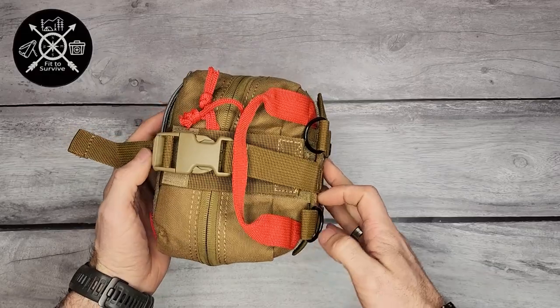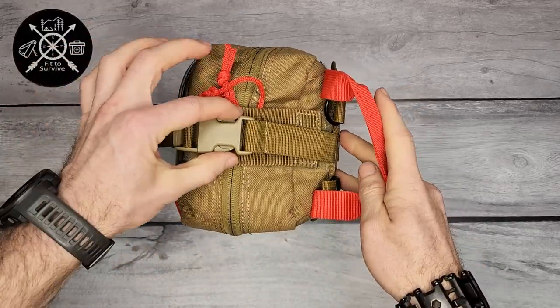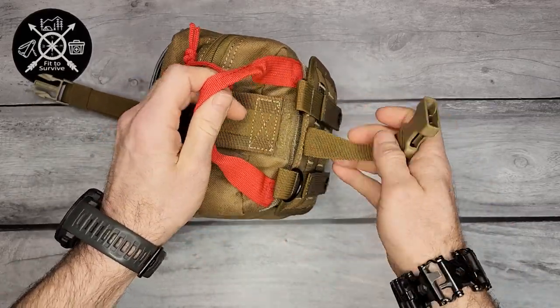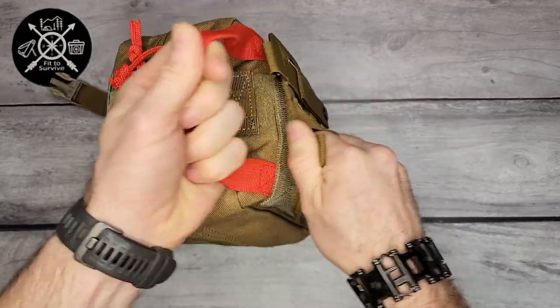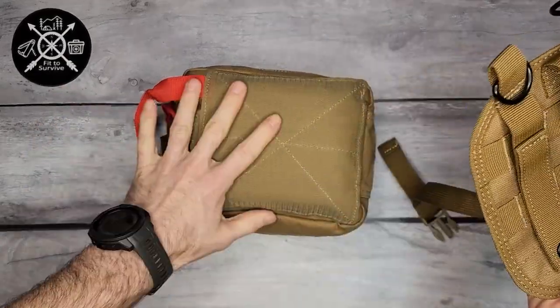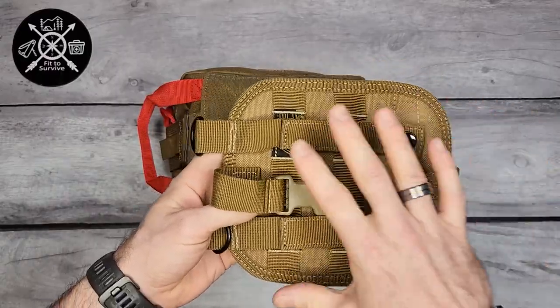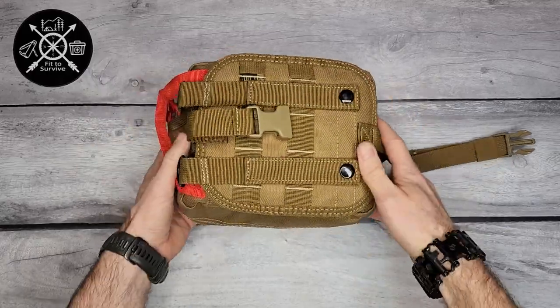The cool thing about this back section that connects to your belt or backpack is that it can easily be removed in case of an emergency. Let's say you need this really quick — you snap off this buckle, then pull this off using the red handle. It comes off with this Velcro, making it easily accessible so you can take it to wherever it's needed.